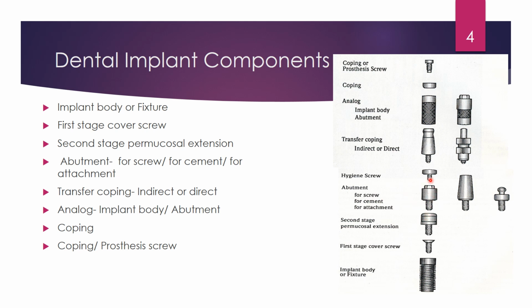Okay, coming to the abutment. These are the attachments where the implant will seat. Okay, so an abutment can be a screw type, it can be a cement type, and also it can be an attachment. So these are the different examples of an attachment. Okay, abutment.